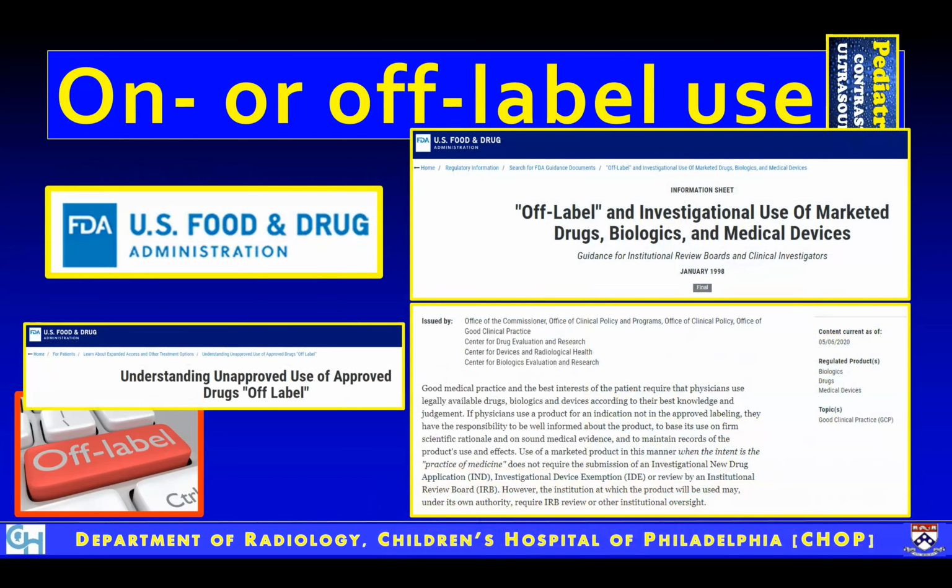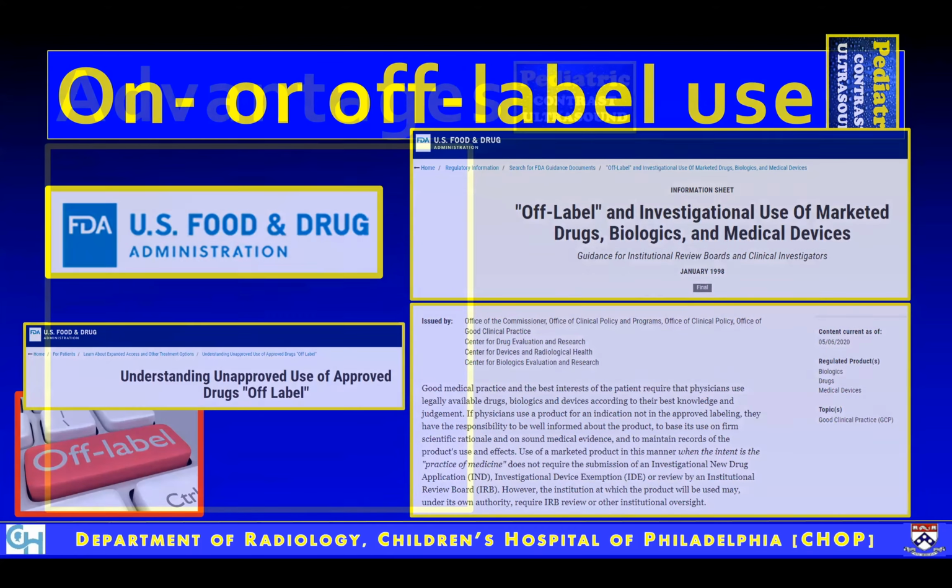If you go to the FDA website, there is clear mention of off-label use, and it states also that the use of marketed product when the intent is the practice of medicine does not require submission of an investigational new drug application. So this is something also explicitly stated by the FDA.